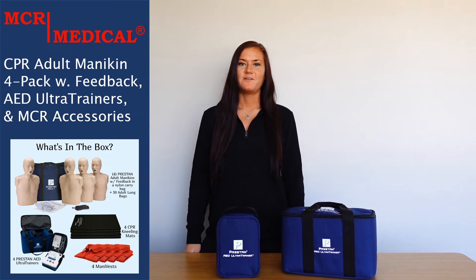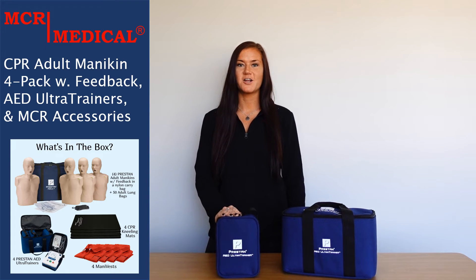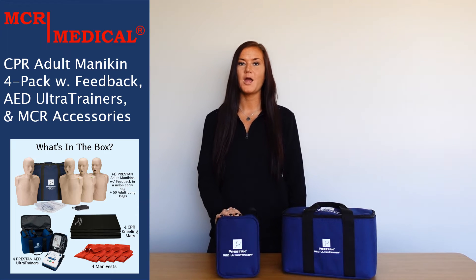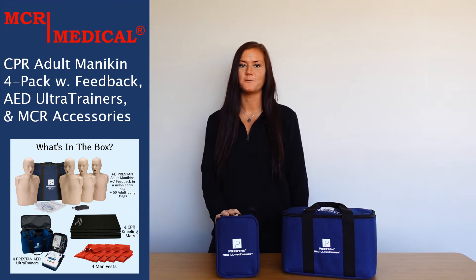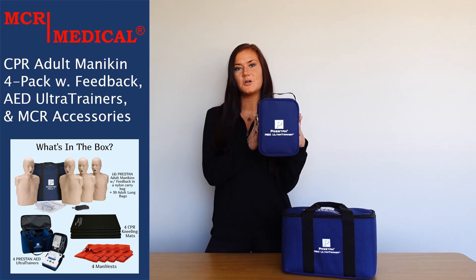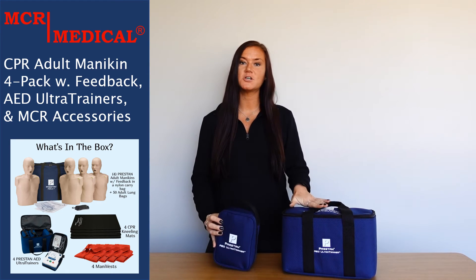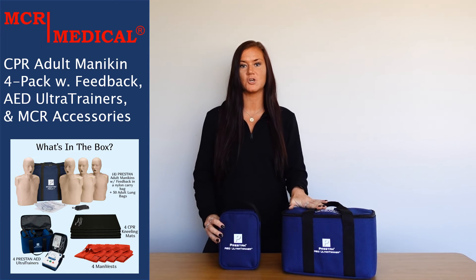We also wanted to highlight a few features of the four Preston AED ultra trainers that are included in this kit, but for more helpful information please feel free to check out the videos I have linked below. Each AED trainer comes with its own zippered heavy gauge fabric nylon carry case with a handle, and you'll also receive a larger carrying case to hold all four trainers.